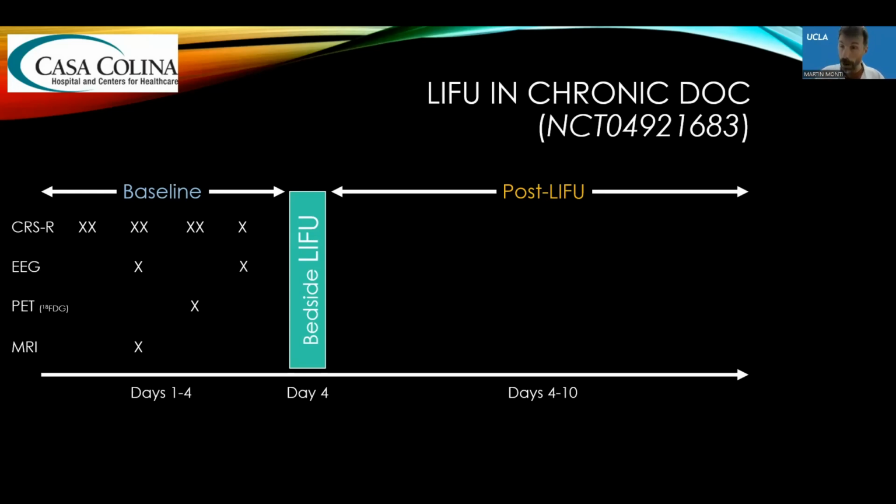So in this new clinical trial, which is ongoing, we first bring patients to our facility in Pomona at Casa Colina. And we first do an extensive baseline over 4 days. So we do multiple clinical assessments, a couple of electroencephalography recordings, PET, and we collect one MRI. After this, we administer focused ultrasound, and in fact, we administer double the dose that we administered in the first trial. So we administer 10 minutes of ultrasound over 20 minutes.